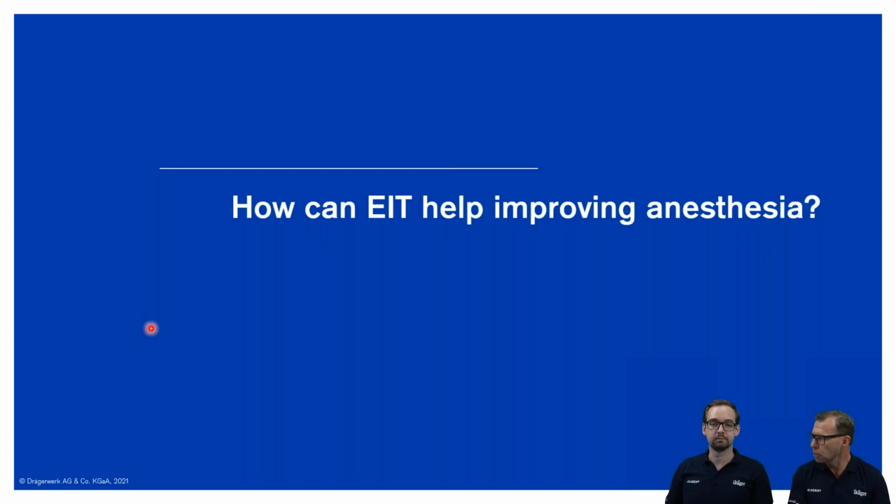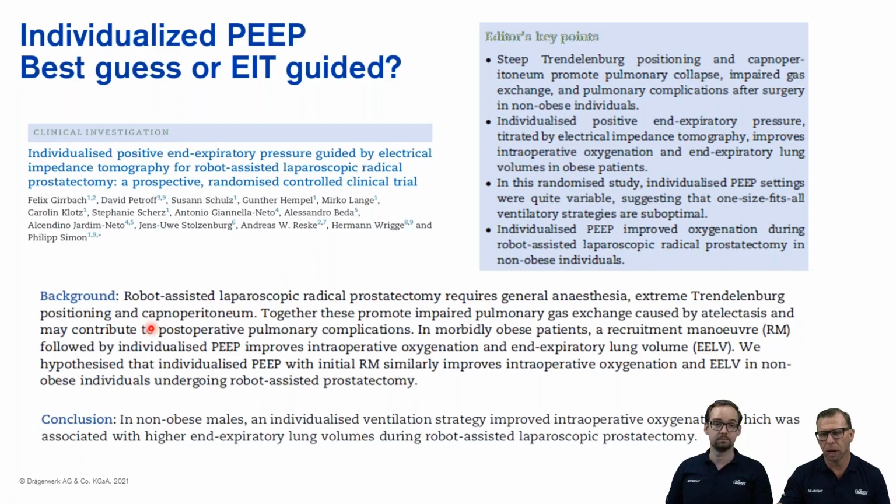So a very new thing for the OR, something that we're not that familiar with in the operating room environment, but now definitely has approval to be used in the operating theatre environment, is EIT. And looking at the Pulma Vista in particular from Dräger, and wondering whether or not it can actually help improve anaesthesia and anaesthesia decision making.